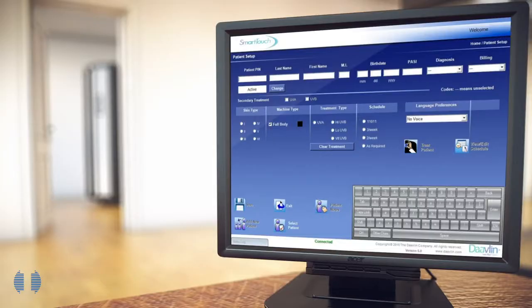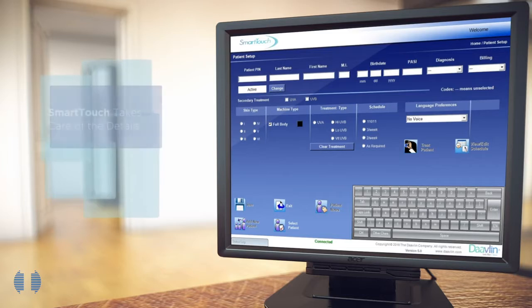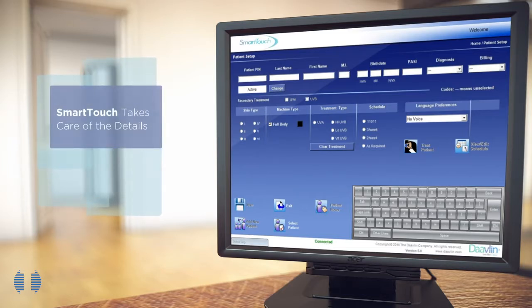Carefully conceived and time tested, Smart Touch takes care of the details, giving you and your patients peace of mind.